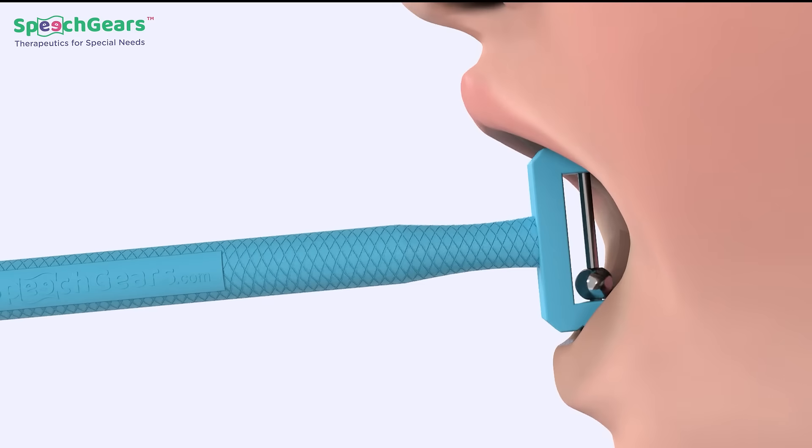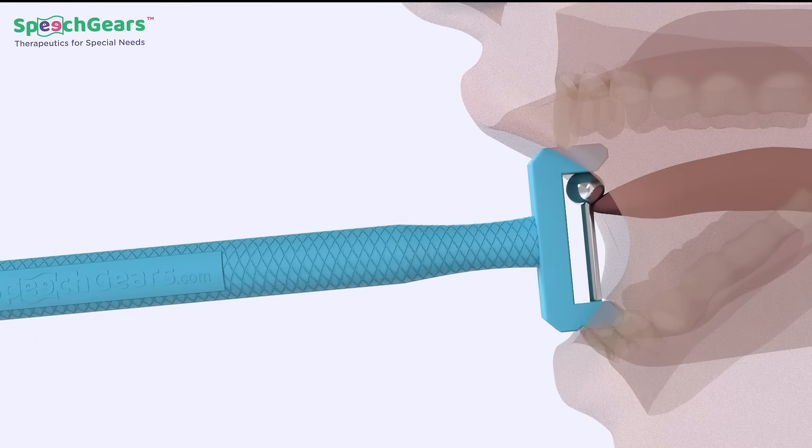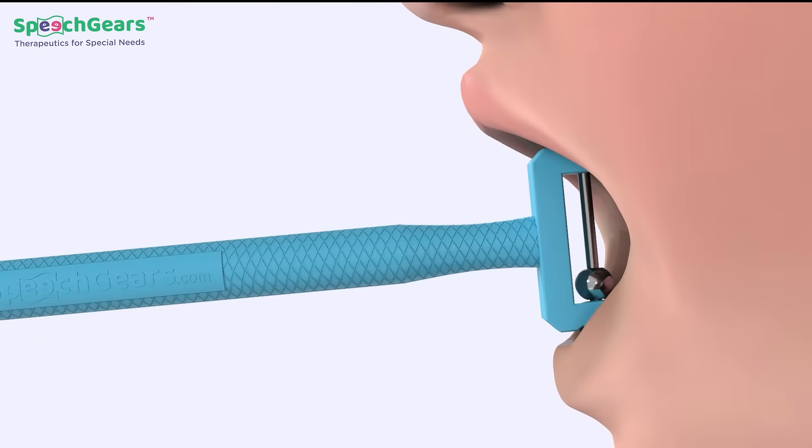Step 2: Move the ball vertically upward then down the ball with tongue. Step 3: Lift the ball upward and hold for 10 seconds. Repeat this activity at least 10 times.